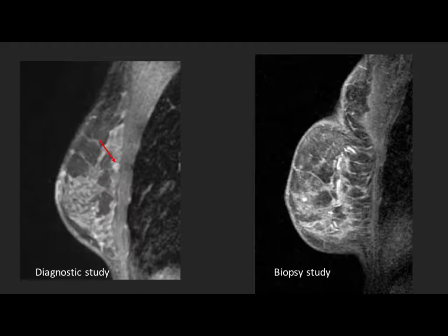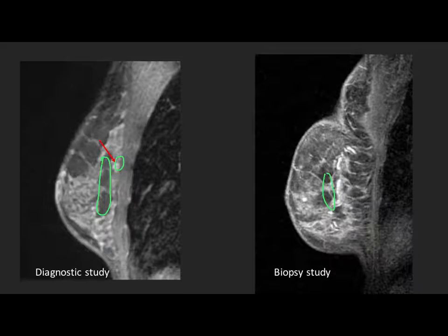This demonstrates what I was saying about the coil — you often have to place the coil inferiorly to allow access to the most posterior row of grid holes. Here's a shown example in a patient with a nice posterolateral lesion — you can see how close to pectoralis it is. Our technologists used those tricks, and you can see how much further anterior they got the breast because our grid is all the way back here. See the shape of pectoralis showing how much they pulled that breast tissue down.